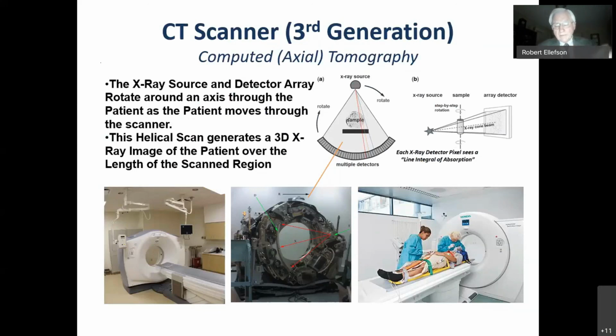In the center, if you take the hood off from the donut, you see that there's a bunch of electronics and some red lines. On the right side, there is this X-ray source. And on the other side, there are an array of detectors. And in the center is where the patient will go. This whole system, the detectors and the X-ray, rotates around the stationary sample, namely the patient.